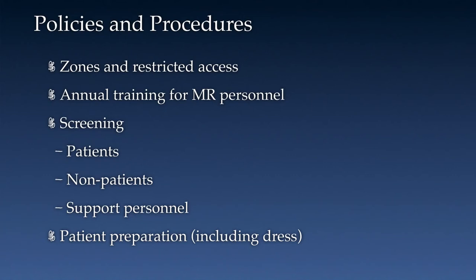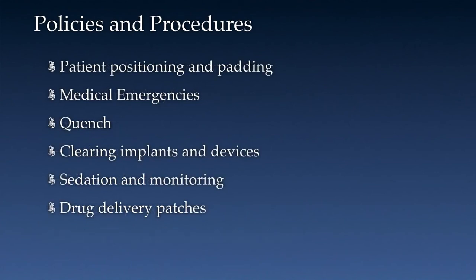You need to have annual training in place for MR personnel. Screening policies and procedures for patients, non-patients, and support personnel. And again, these need to be enforced. They need to be followed consistently. Here's a big one: patient preparation, including dressing patients in MR appropriate attire. I see this a lot. We have a policy in place. Do you always do it? Well, no, not always. What about patient positioning and padding, using appropriate padding to prevent burns?